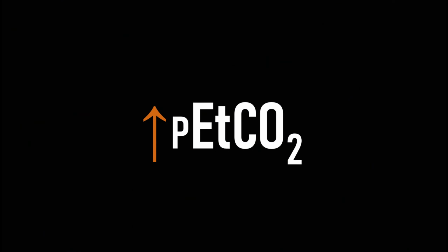If the partial pressure of end tidal CO2 is over 40 millimeters of mercury or 5.1 kilopascals, it is elevated. What does this indicate?